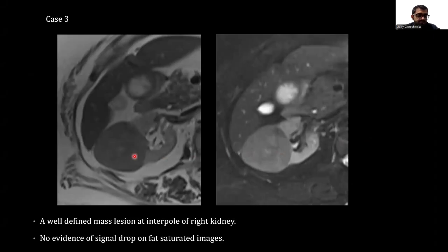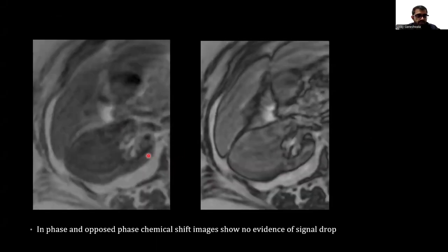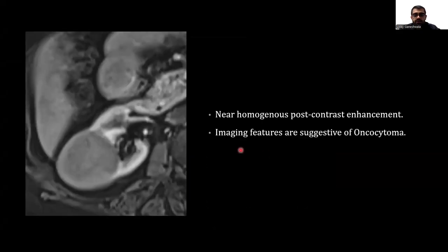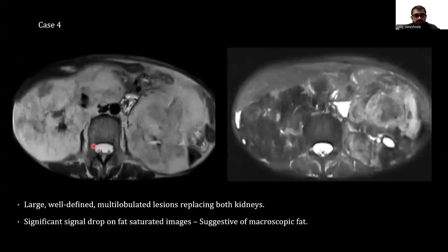In this case, we can see a well-defined mass lesion at the inter-pole of the right kidney. There was no evidence of signal drop on fat-saturated images. In-phase and opposed-phase chemical shift images show no evidence of signal drop. Diffusion restriction on DWI-ADC images was noted, and near homogeneous post-contrast enhancement was noted. Imaging features are suggestive of oncocytoma.